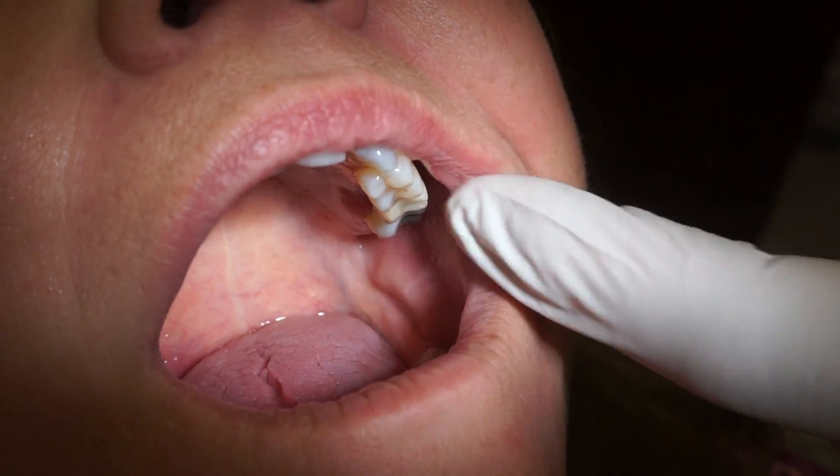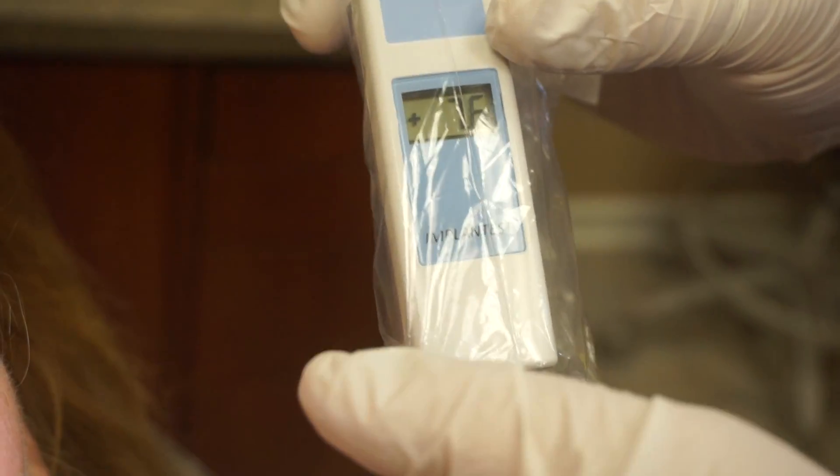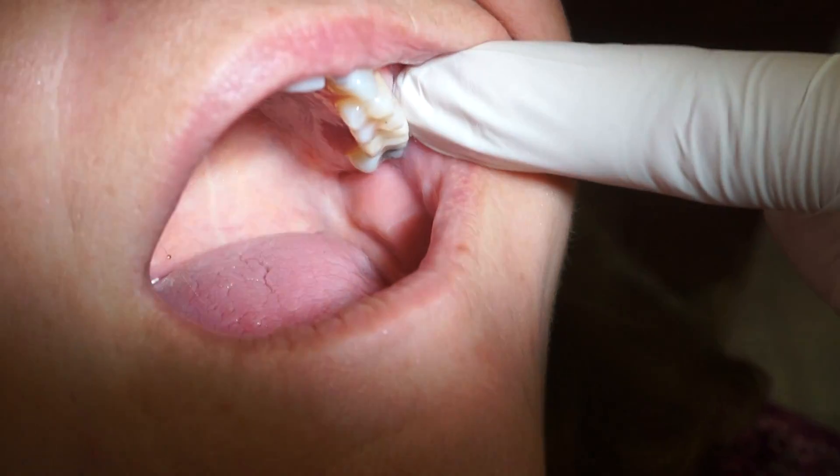So we're at about a 7.5 rating on the implant test. That's a very stable rating, one I'm very happy with. As you can see, this is very simple to use.